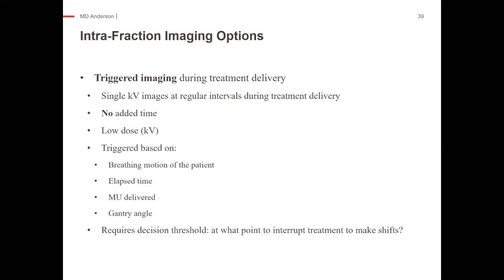Or you could do a triggered imaging technique, which is kind of at the forefront of intrafraction imaging. So it's basically a single KV image that's taken at regular intervals during the treatment delivery. So it doesn't add any time because you take it while the beam is on. It's low dose, it's KV image, and you can trigger based on the breathing motion of the patient. So if it's a gated patient, you can take it at every expiration or inspiration.